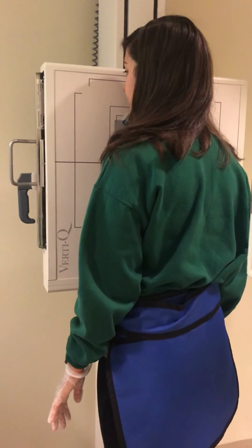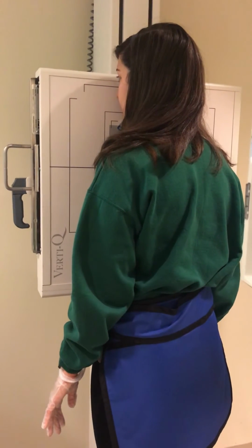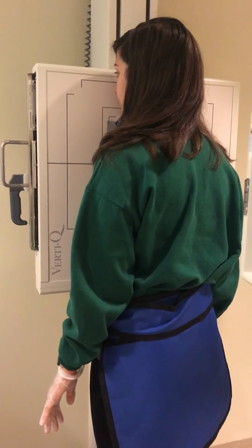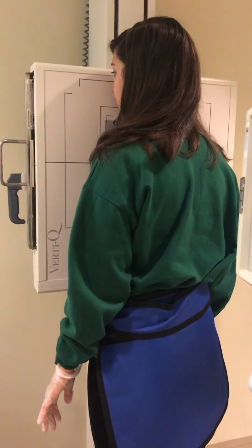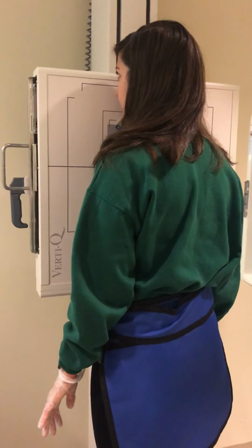We do the RAO instead of the LAO because this is going to put the heart shadow as a backdrop behind the sternum so that you can have an equal density to be able to see the jugular notch, the manubrium, the body of the sternum, and the xiphoid tip.